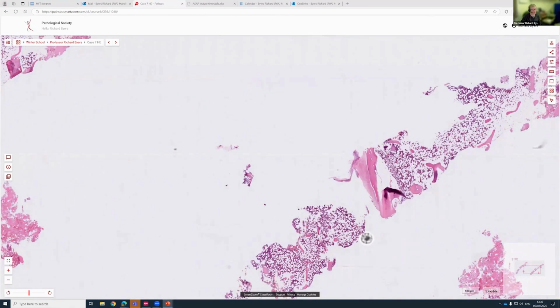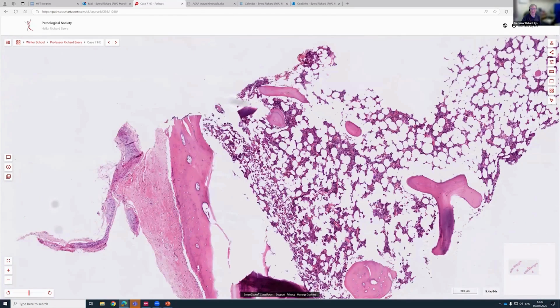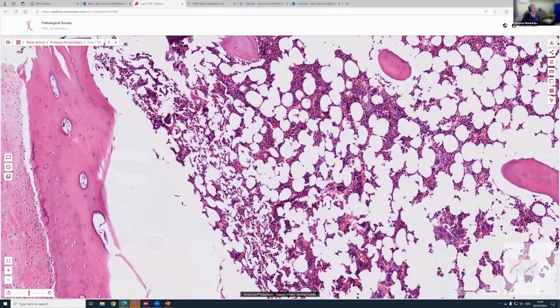It's going to be essential thrombocythemia because, as I say, they're not going to give you really difficult cases in the defined section if you get it. And it will be a long case because they'll have to give you the retic, the immunos, and so on. Because if it was really difficult, they'd give you so much information you would not have to look at the slides. So setting trephine cases is actually quite difficult for the exam because you have to find really classic cases that are simple. Otherwise, you just read the history and there you are.